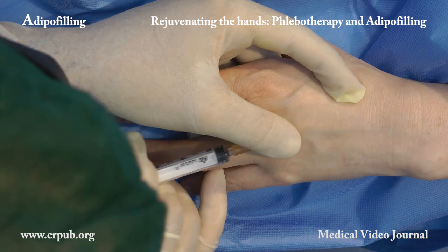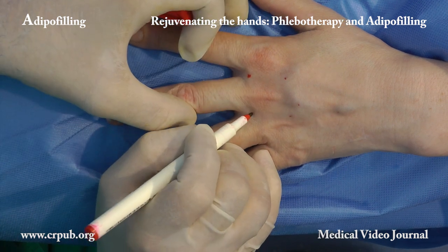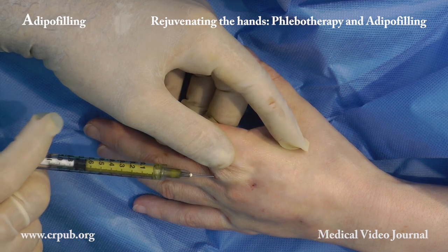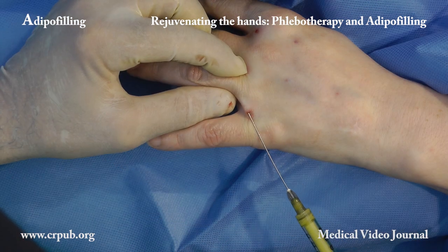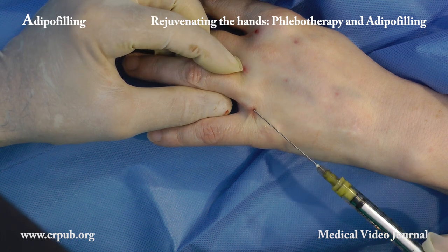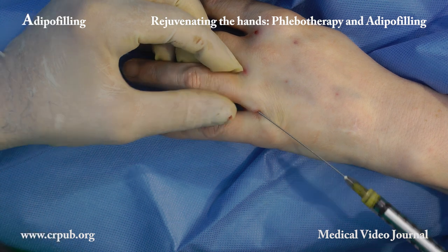In some patients, phlebotherapy is also carried out in the veins of the forearm. We now perform adipo-filling of the left hand. Adipo-filling transforms an aged hand into a young hand. This simple ambulatory procedure permanently corrects one of the most evident and least manageable signs of aging.